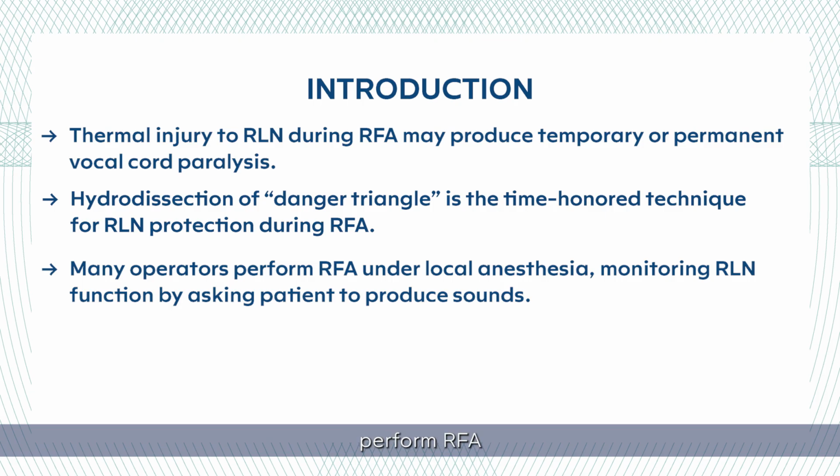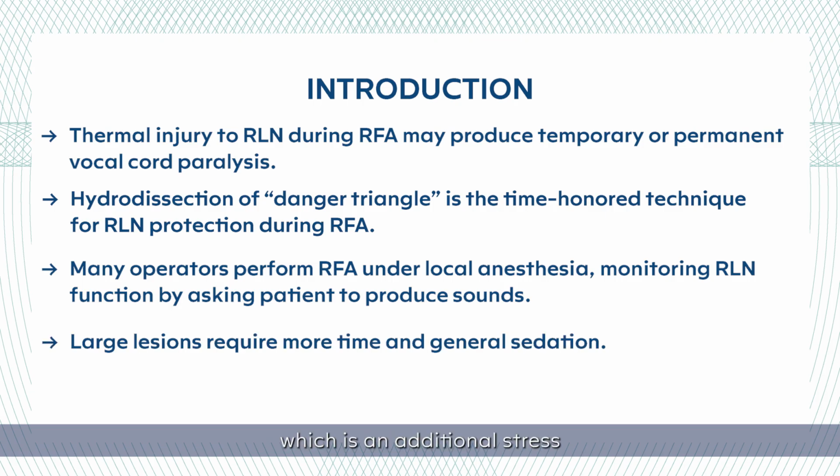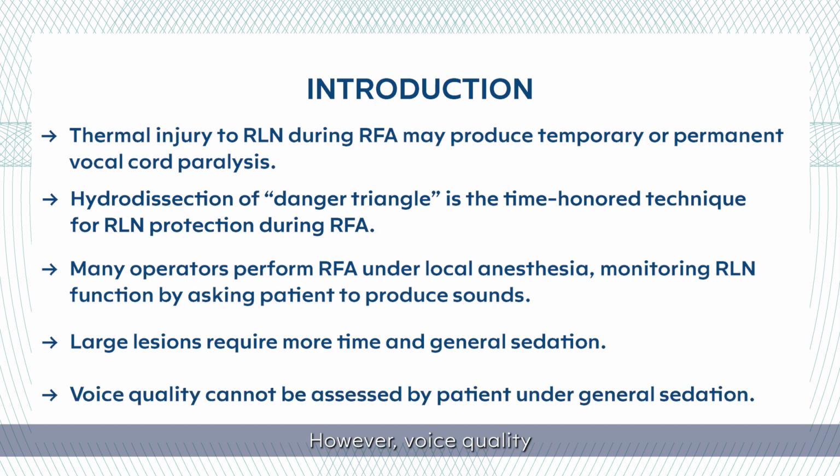Many operators perform RFA under local anesthesia, monitoring RLN function by asking patients to produce sounds, which is an additional stress for the patients, especially for large lesions that require more time and general sedation. However, voice quality cannot be assessed by patients under general sedation.